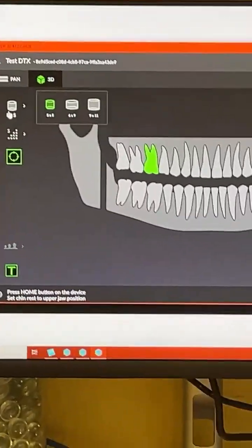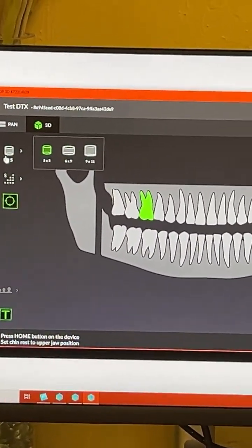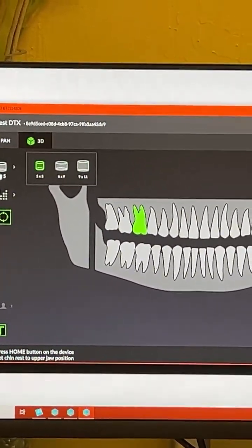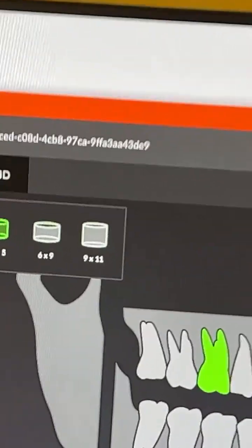Got it. And you'll see the lights on the face. It'll be on the face, 6 centimeters in height from the inferior border to about the top, to about here where the crowns are. That's good. That's why we give you 6. 5 will be a little bit shorter and not quite as round. So maybe for 2 to 3 teeth at the most.